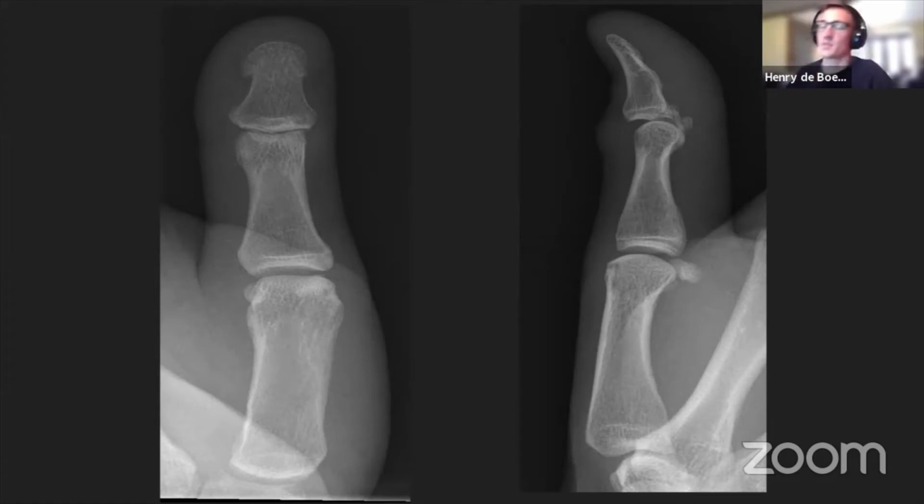Okay, yeah, so starting to get some answers coming through. Some people correct, some people slightly less correct. Wait for a couple more answers to come through so we can get a consensus for what we'd call this. And it's really good that I can see you're all trying to put loads of detail into your answer as well, which is good to see.